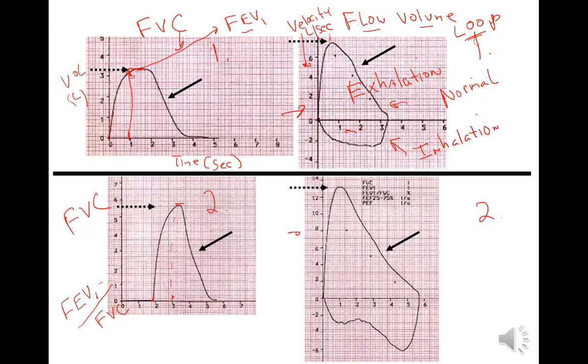So now if you have COPD, this top is not going to be pointy. It's going to flatten out, which Dr. Lee will show you in lecture. But this is not FVC now. Everything changed because the machine changed it. Question? Can you get like the total capacity from like the top one? No, you can't get any of that from this.